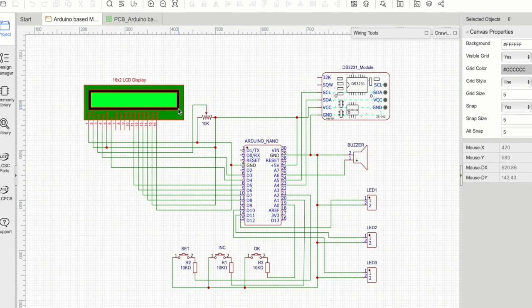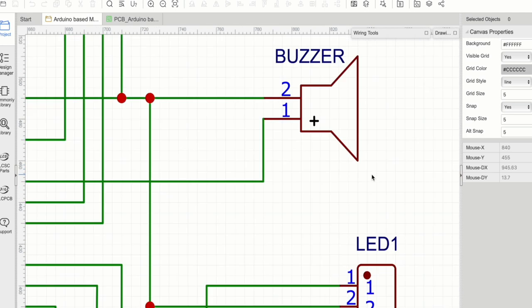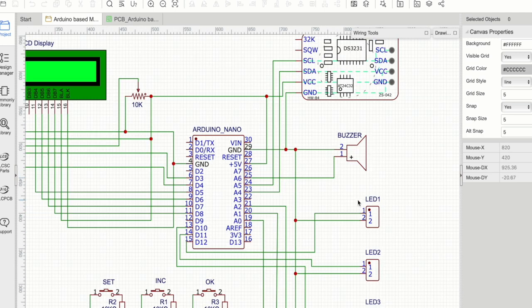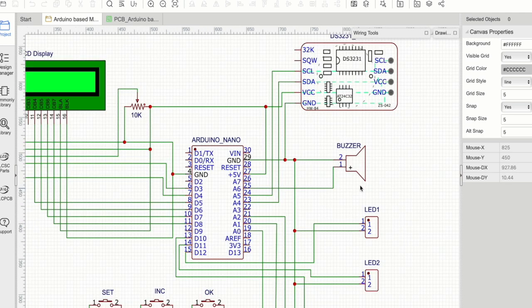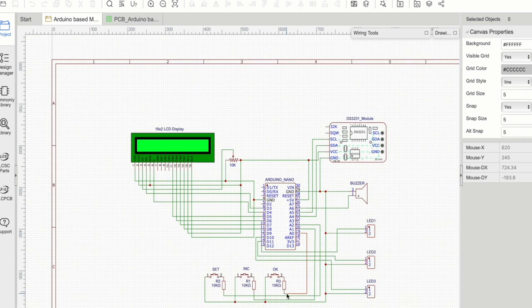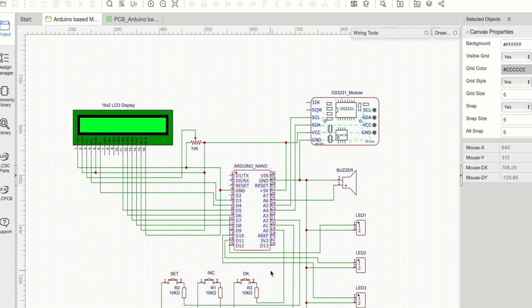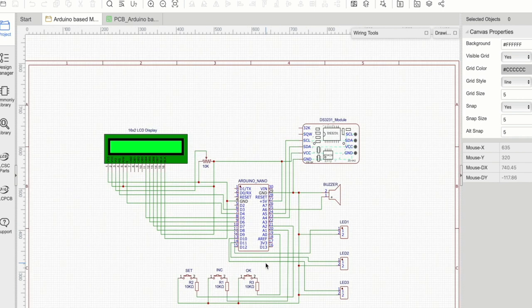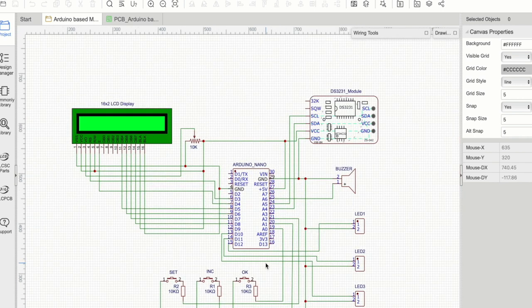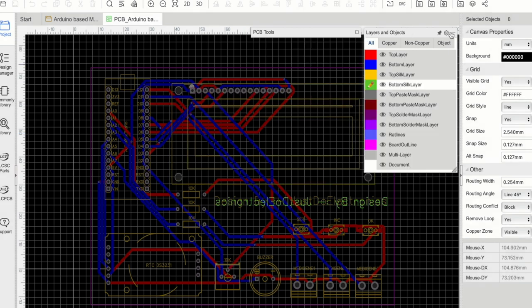This is the circuit diagram of the project, designed using EasyEDA software. I placed all the components — Arduino Nano, RTC module, piezo buzzer, three LEDs, three push buttons — and connected them to the 16x2 LCD display as well. I then converted this circuit diagram into a proper PCB layout.